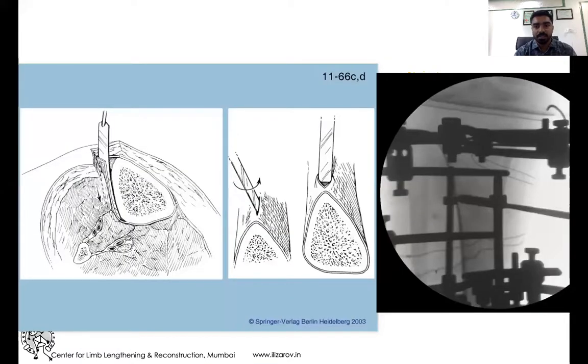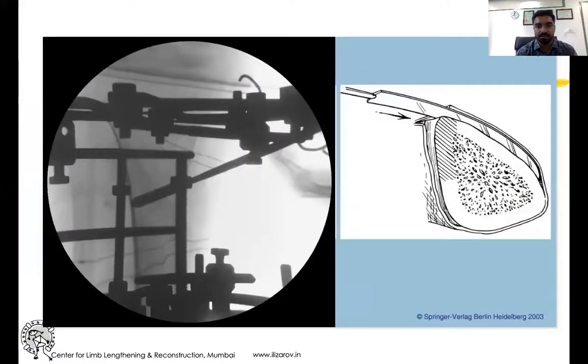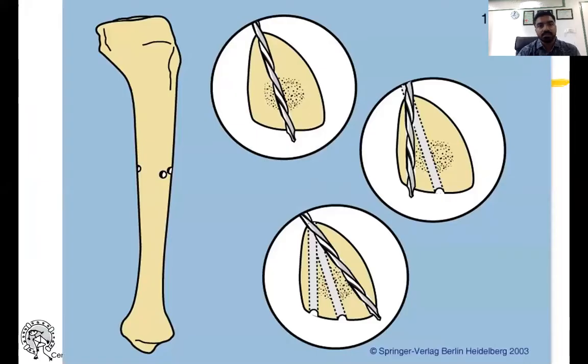You can see in the image as well as the C-arm image the periosteum being elevated on the lateral side and then on the medial side. Then we use a sharp drill bit, around 4.5 to 4.8 millimeters. Use the drill sleeve and put multiple holes in different directions from the same two-centimeter incision.